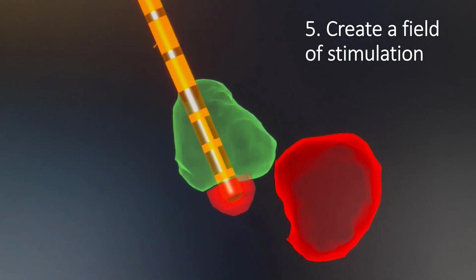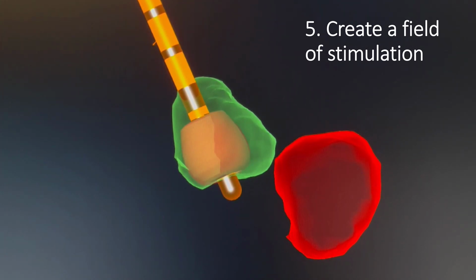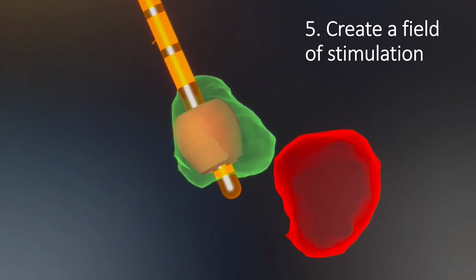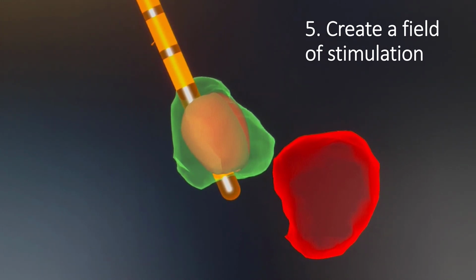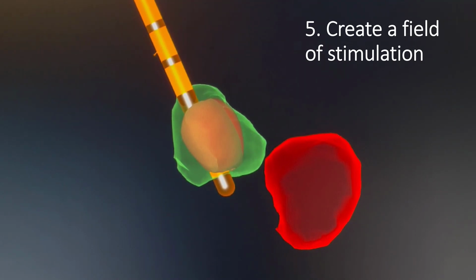You can now decide more in detail how you want to shape the field of stimulation, first in your mind and then in the model by changing the stimulation parameters and moving the field of stimulation. As I mentioned earlier, we do not know exactly where to stimulate within the target area, and the same stimulation fields will not have the same effects in all patients, but a visual analysis will point us in the general direction, and we can avoid spending time on exploring stimulation fields with little chance of success.